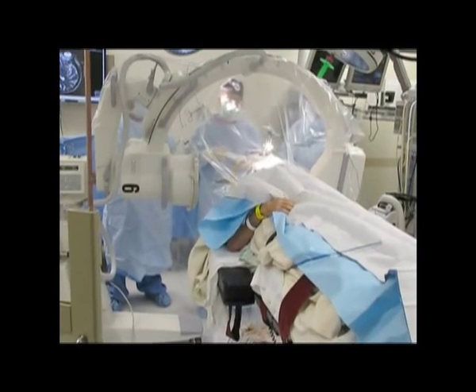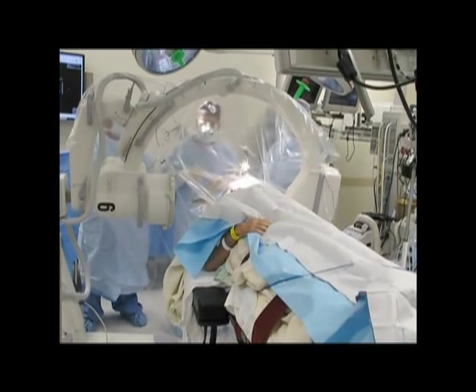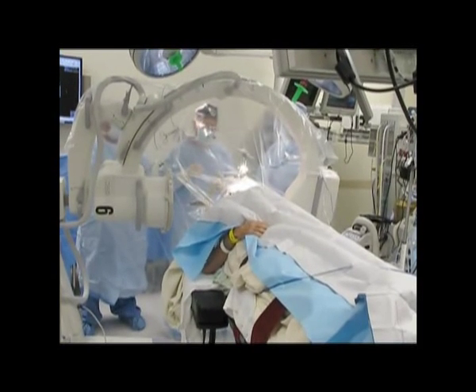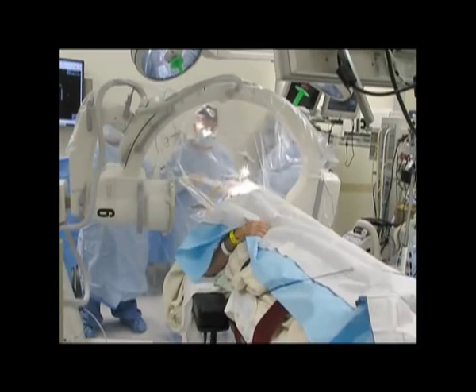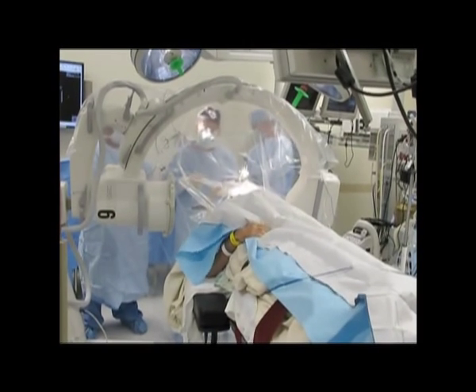Can you count backwards from ten in increments of two? Good job. Can you count to ten now? So right now we haven't put the electrode in the target. We're going to put it in, and hopefully we're going to see some improvement, okay?